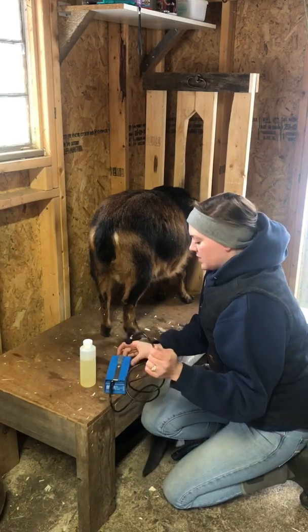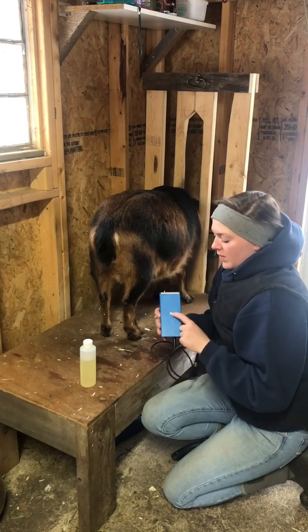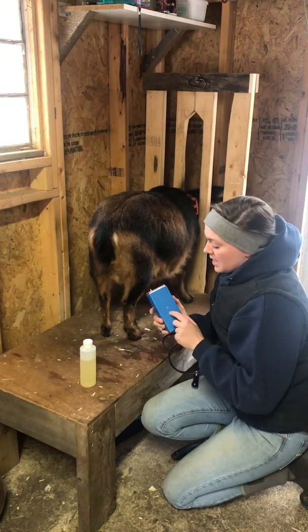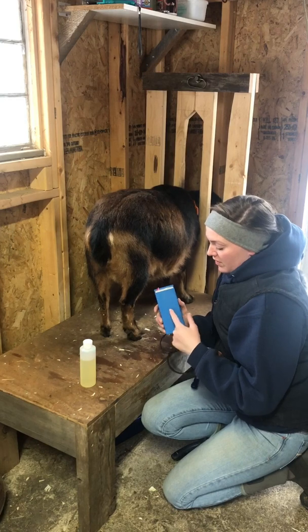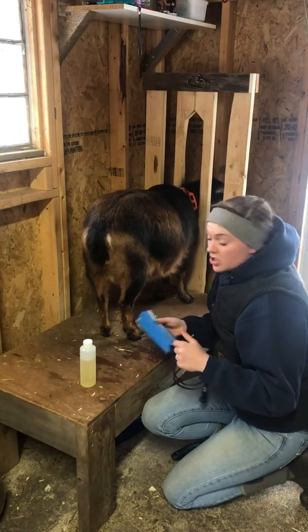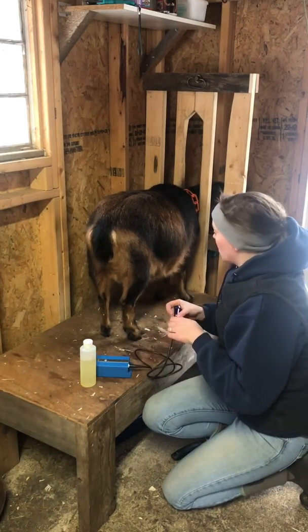Turn this thing on — it is set to goats. When I did it with Big Marie, the PregTone multi-species actually comes set for pigs. The way that you change that is by removing the screw here, and then there are just little jumpers in the back that you have to move. It comes with instructions on what the goat setting is, based on the size of the goat as well.